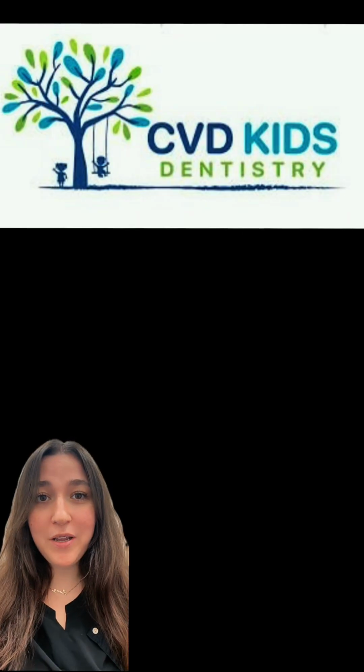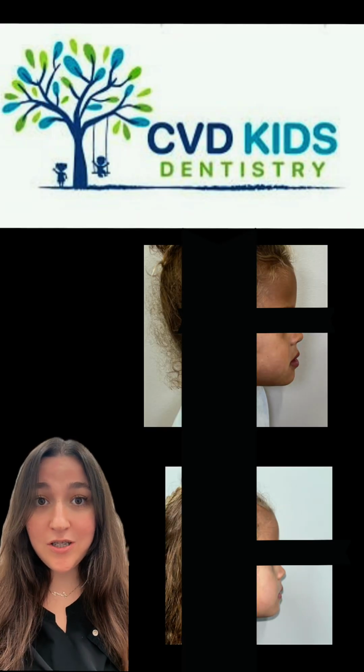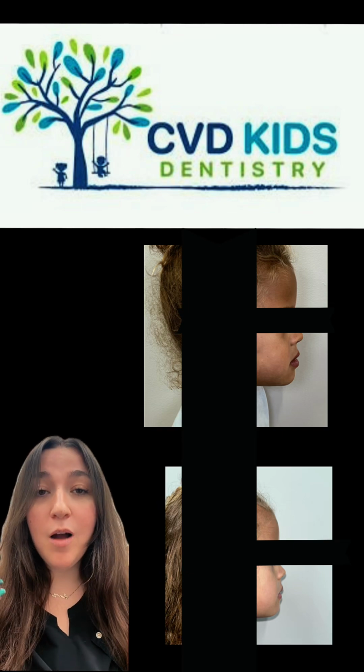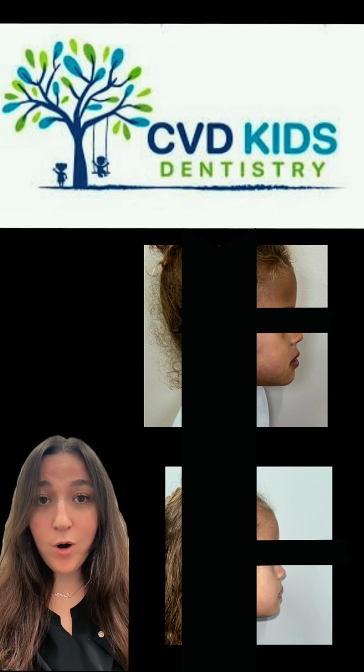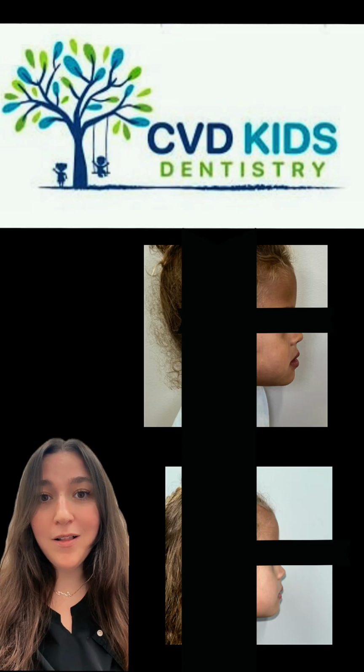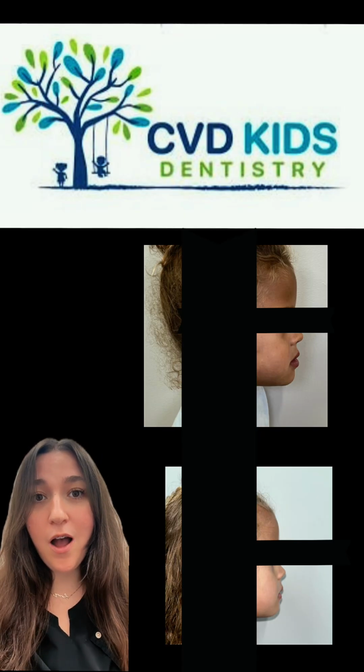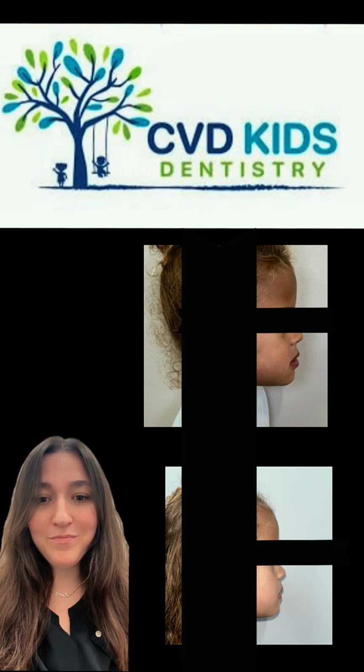What's super cool is you can actually see that her profile has changed significantly. Her lower jaw has stayed the way that it is, but her upper jaw has developed more forward to create a more straight profile, whereas before you could tell that her chin was way too prominent and her upper jaw was underdeveloped. Now let's go through an overbite case.